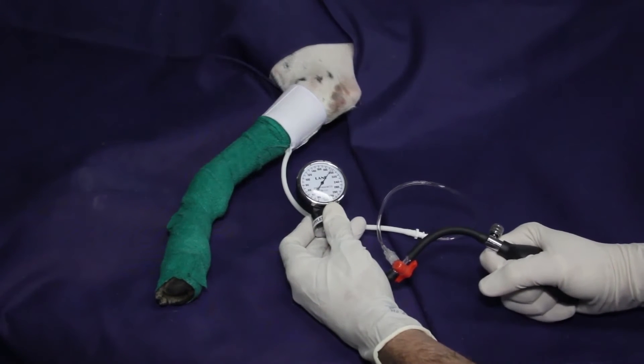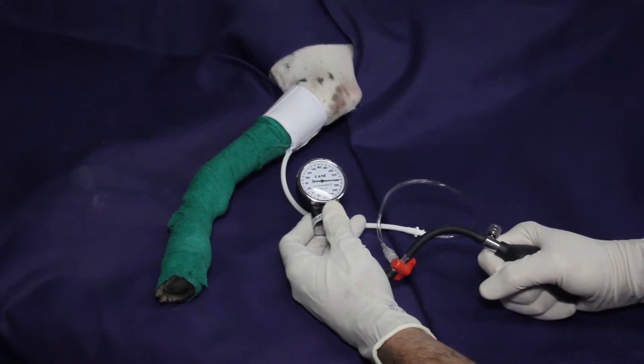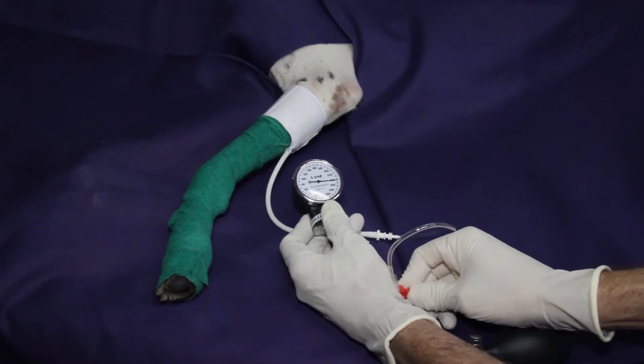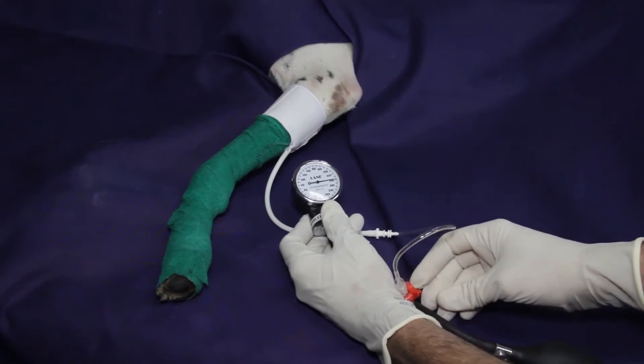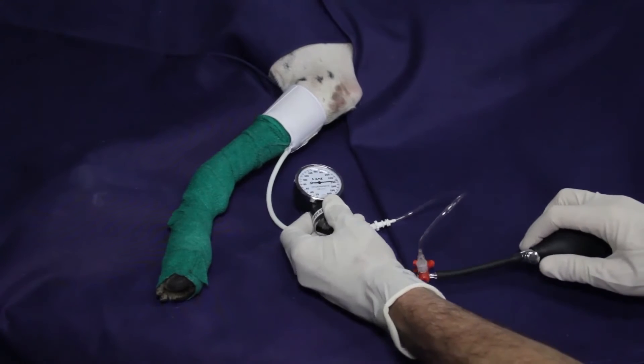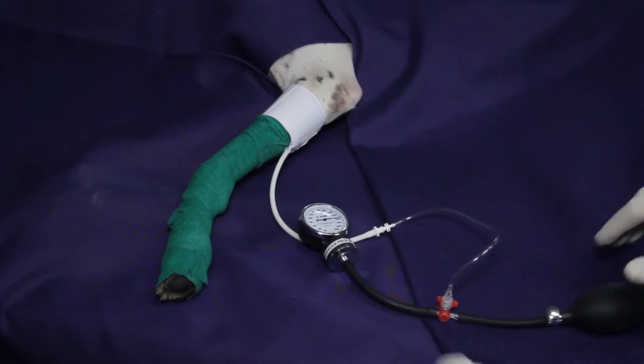The cuff pressure should be 50 mmHg above the systolic blood pressure to ensure adequate occlusion. The elastic bandage is removed, and 2.5 to 5 mg/kg of 1% lidocaine without epinephrine is injected slowly.